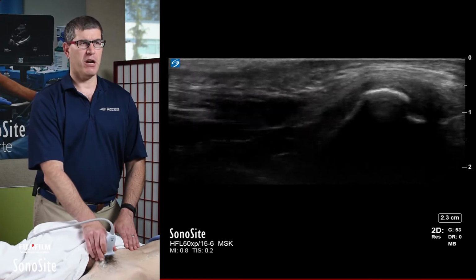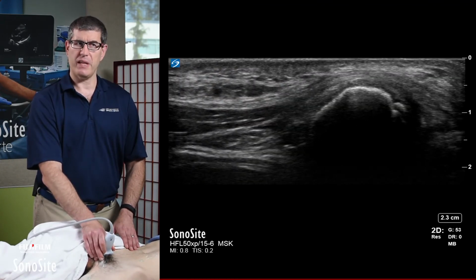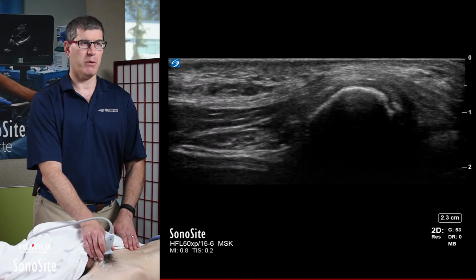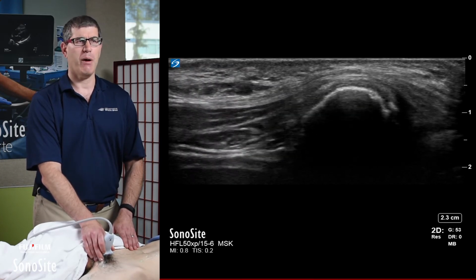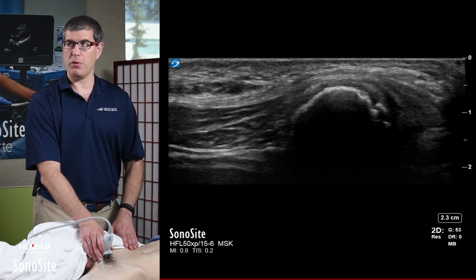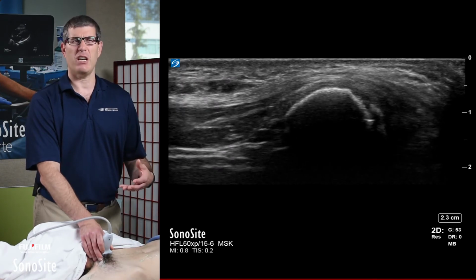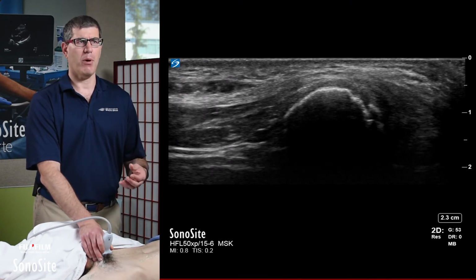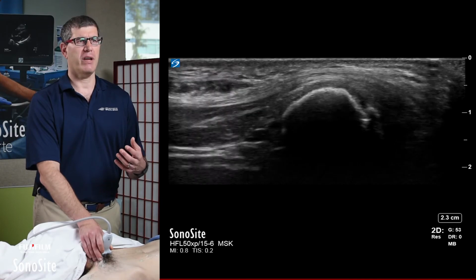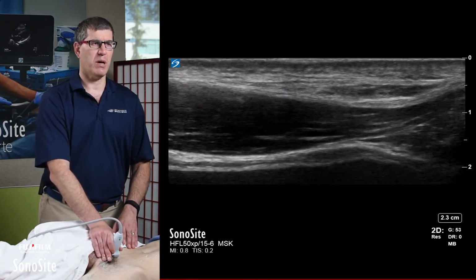As I come over here, now we're in the plane of the rectus abdominis. So the rectus abdominis is on your left, and that's more proximal, and then you have the superior pubic ramus and pubic tubercle. And what can happen is that tight fibrillar architecture overlying the pubic tubercle, you may find in that area that you'll see, again, the classic signs of tendinotic injury, where it might be hypoechoic, it may have an absence of normal fibrillar architecture, and then you can go into the rectus abdominis musculature.